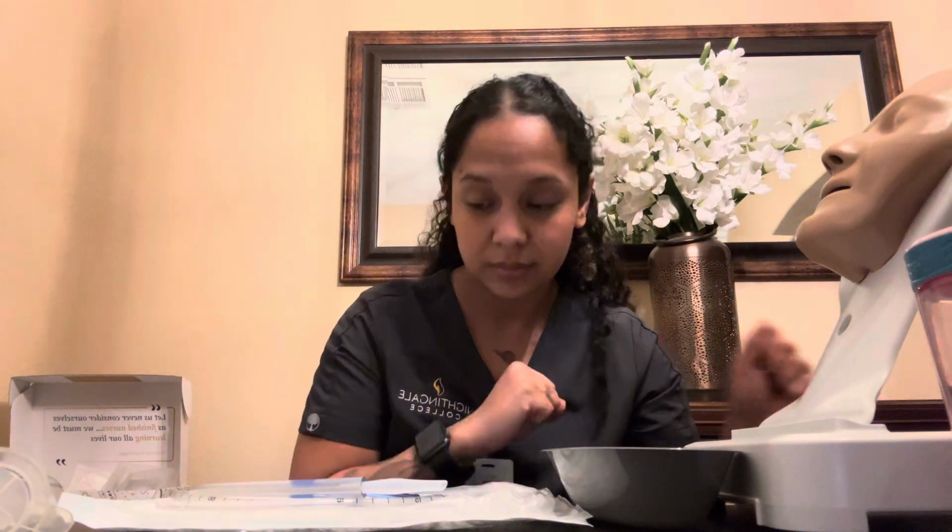Okay. Now we're going to get ready to put it in. Anyway, sorry, I don't know if I said it earlier. I wash my hands, put on my gloves, right? It's kind of hard when I'm not in the actual room. Wash my hands, put on my gloves before I even touched her, by the way.